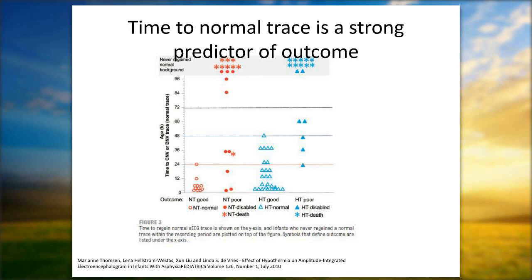Gabriel, are you using hydrogels for your preemies, or are you using needles? Needles. So even for the small ones. Do you find the staff are quite keen on using the needles for the littlest ones as well?